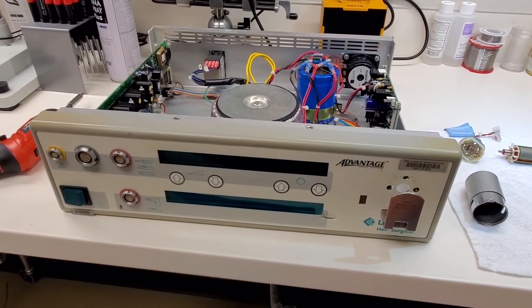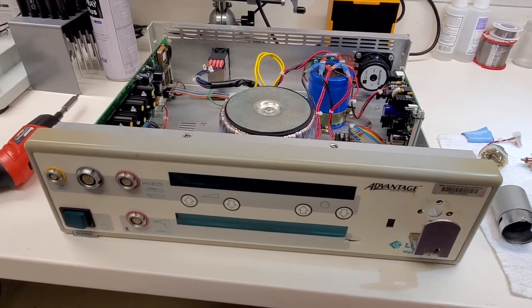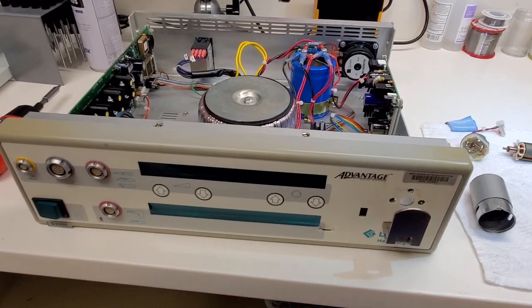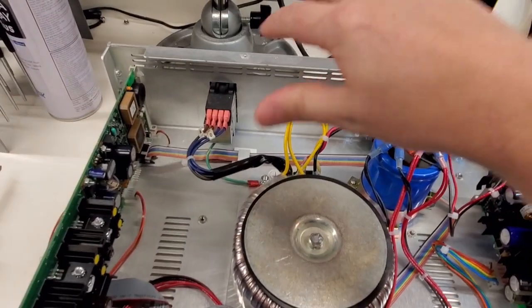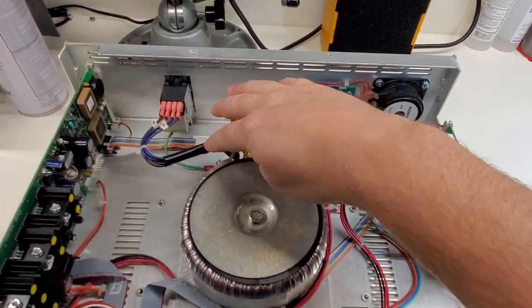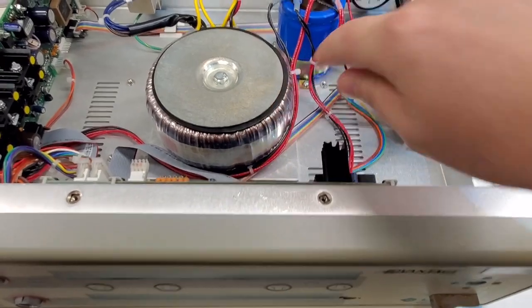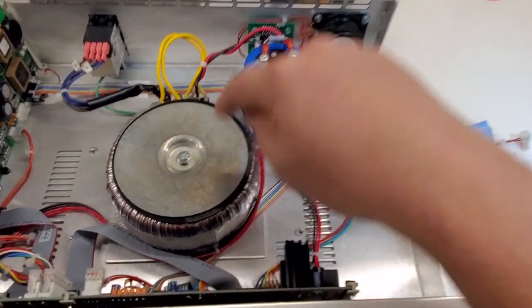This is a 16-year-old piece of equipment we purchased back in 2004. And I'm gonna show you guys what's all inside this beast. You can see we got the AC power that comes in here. It comes down to a step down transformer, and based on the label over here, it says it steps it down to 37 volts AC.